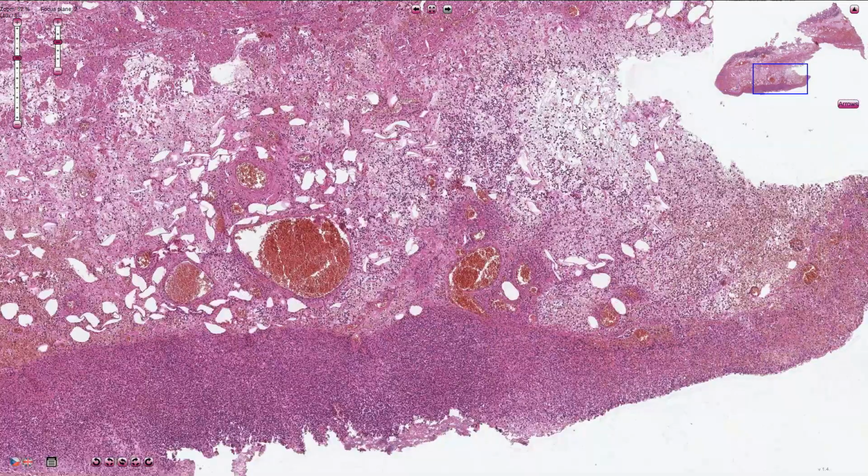The wall of the intestine is typically edematous, and macroscopically, the infarction looks like an edematous dark red area of the intestine. Ischemic damage can be associated with occlusion of the mesenteric arteries or veins, and it can also be associated with general hypoperfusion in case of shock.